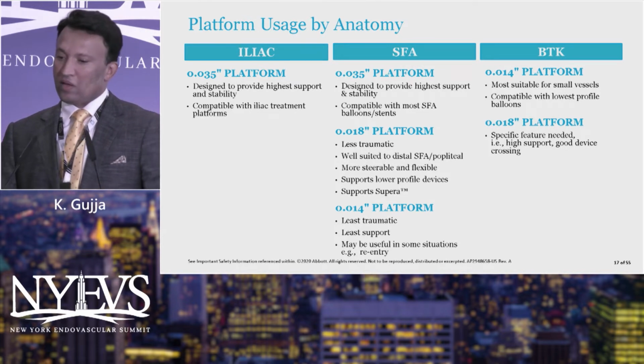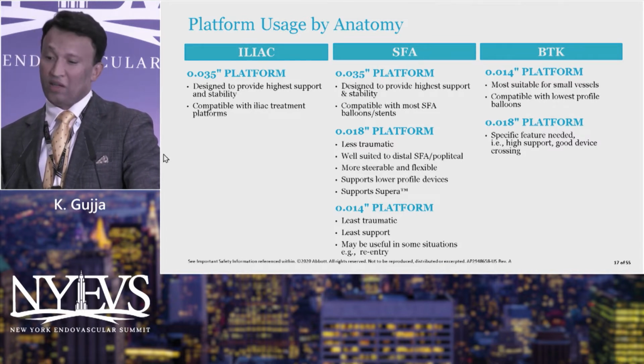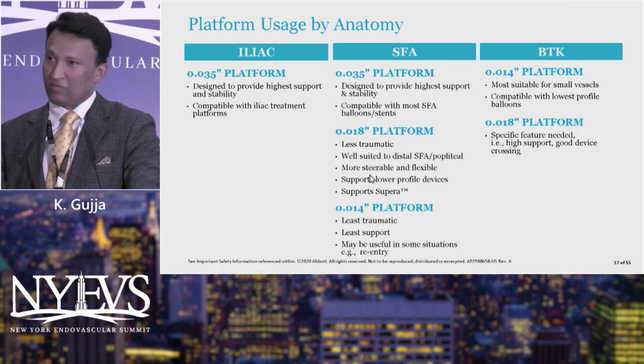So again, BTK platform, as I said, it's basically localized to O14 and O18, and that's what I would do. I almost never use an O18 in a tibial platform, unless it's a very large vessel, more than a 4.0 vessel. Unless I have to cross it and it's very calcified, I almost never reserve it.